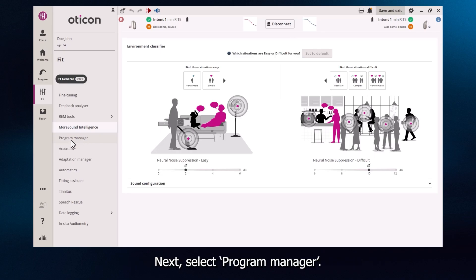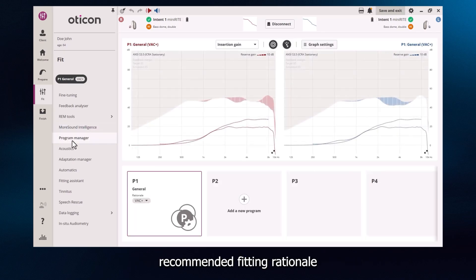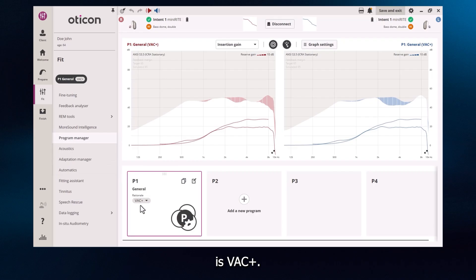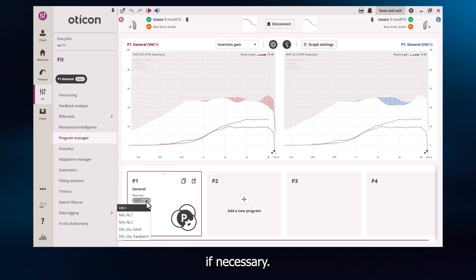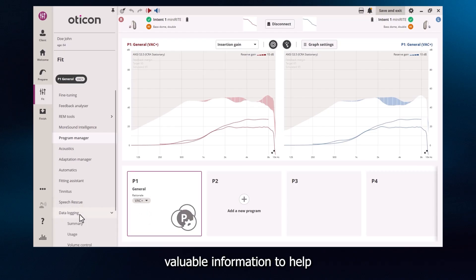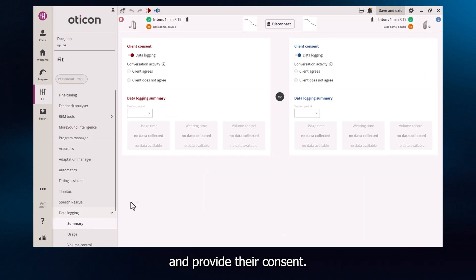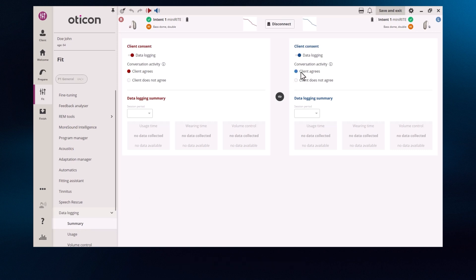Next, select Program Manager. The default and recommended fitting rationale is VAC Plus. Alternative fitting rationales can be selected from the drop-down menu if necessary. Data logging can provide valuable information to help with counselling and fine-tuning at the follow-up appointment. Before collecting data logging information, the client must be informed and provide their consent. Now select Finish to finalise your fitting.